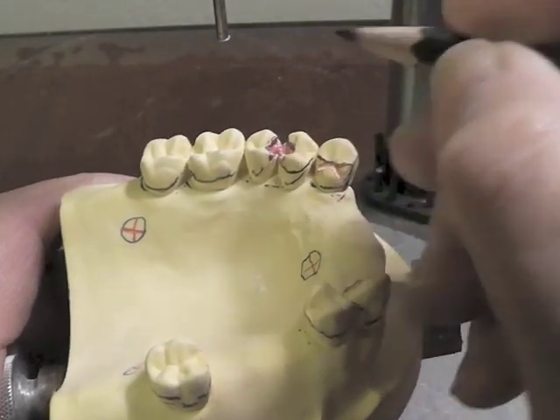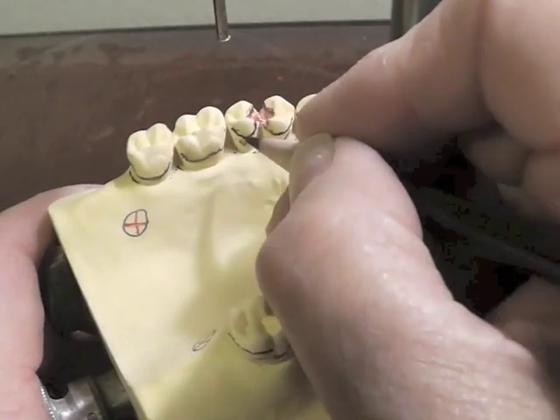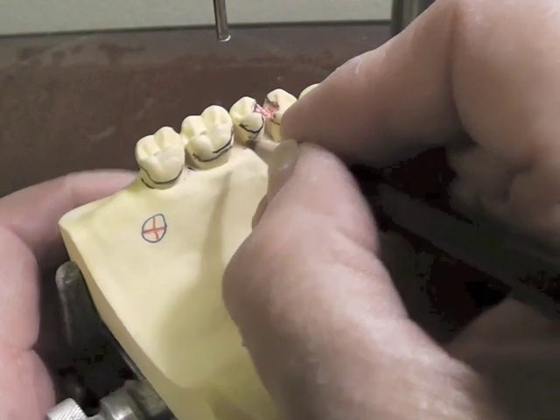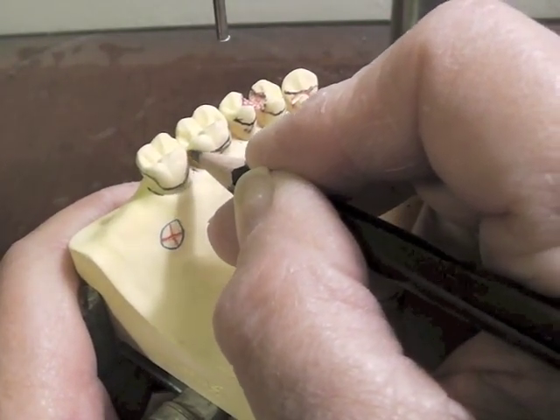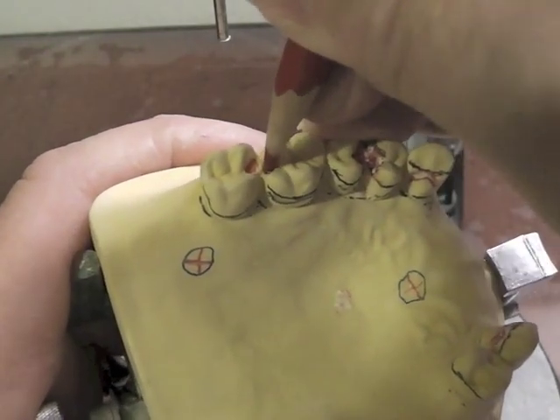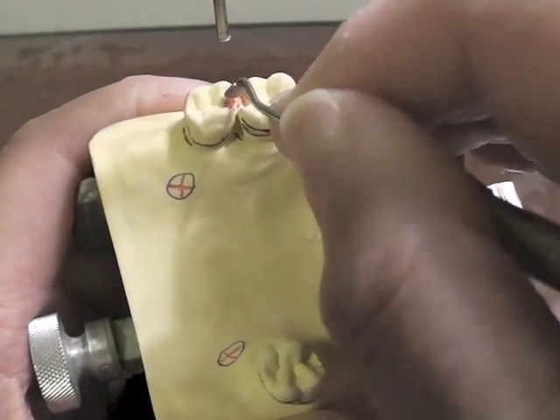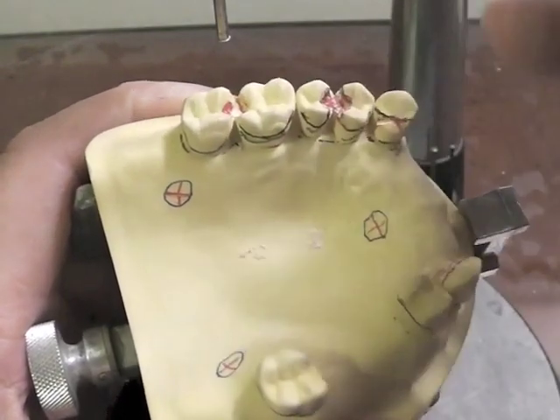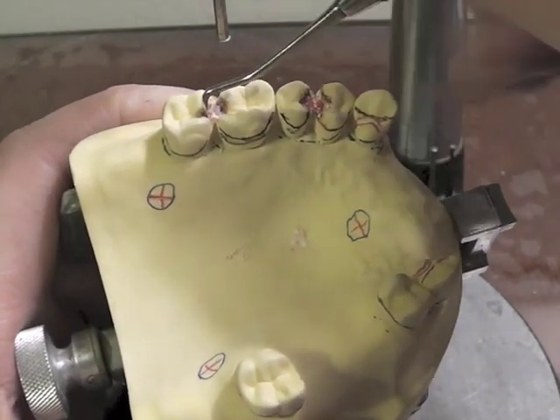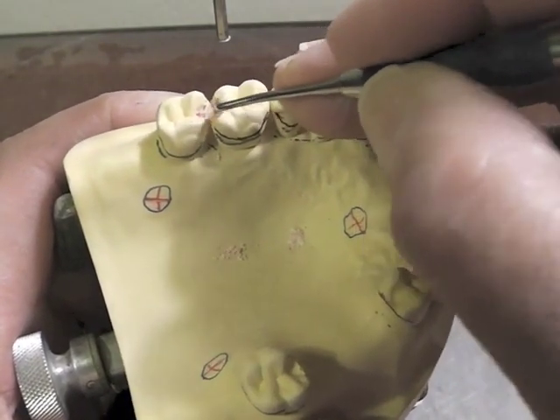Here's our rest outlined. It comes back to this point. We need to come down, stay in the middle third of our tooth, go up, close that embrasure space, come back along the middle third of the tooth. We'd like to stay one or two millimeters above our survey line in the middle third of the tooth. Come up here and we're going to have a rest in that area. We'll draw our rest and we know we have to prepare our rest with some sluice ways. Again, about a millimeter to a millimeter and a half at the marginal ridge. The fossa of the rest will be approximately a millimeter deep and deeper than the marginal ridge. We want it to be spoon shaped. We don't want MO preps, amalgam preps — just spoon shaped.